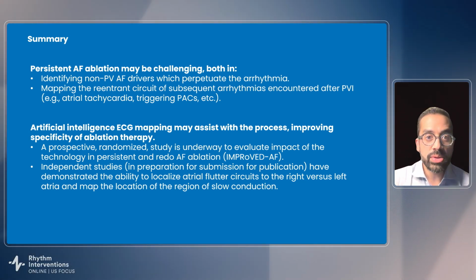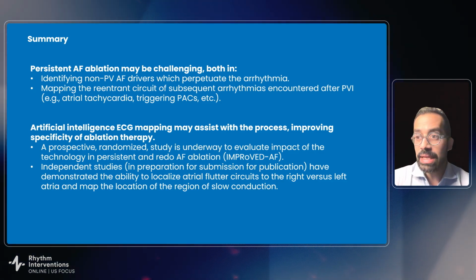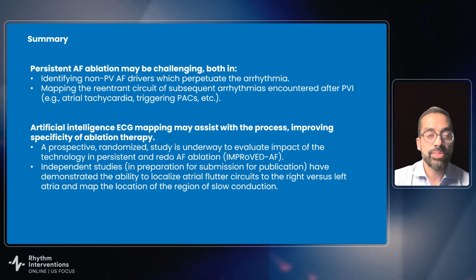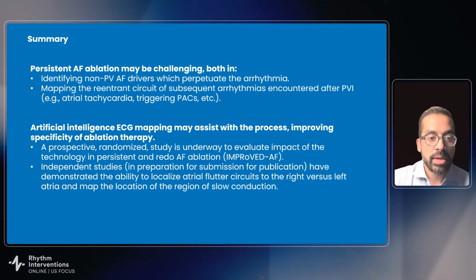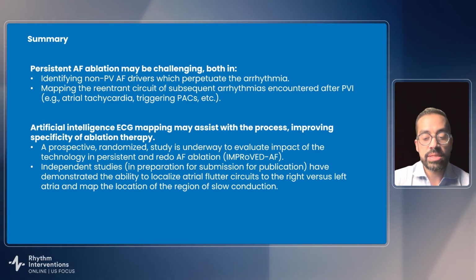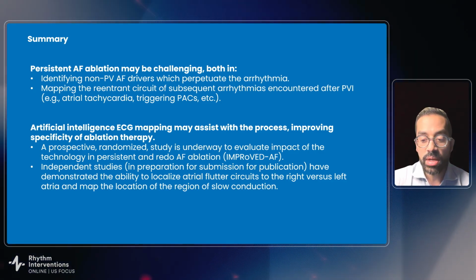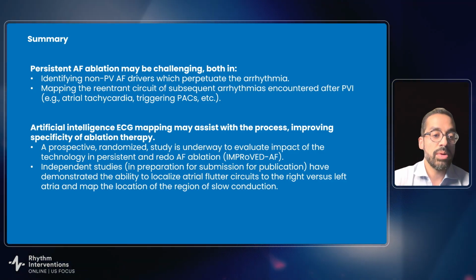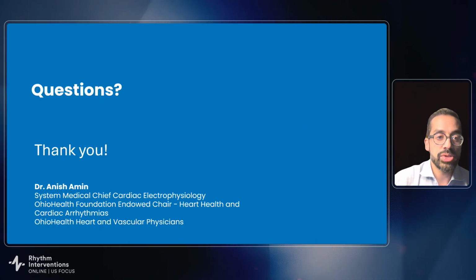But we can also look at these ECGs in the clinic setting, so we can predict what our lesion set, what our workflow, what therapy catheter or therapy solution we want to use, even before we get into the lab. And that's a very potent way for us to maximize efficiency and have a true conversation with our patients around what it is that we're going to be doing when we ask them to undergo an AF ablation.